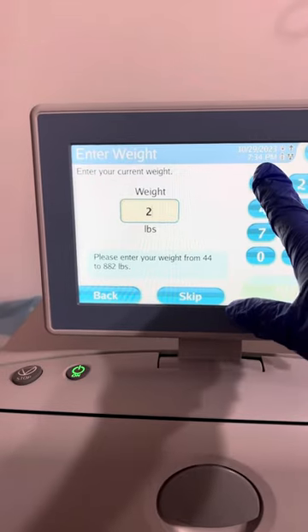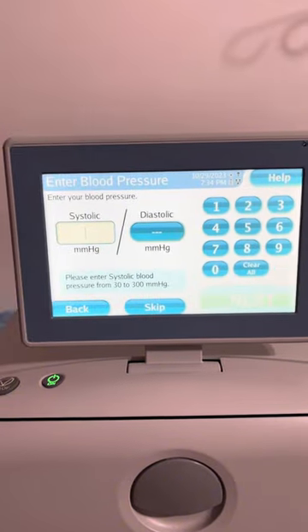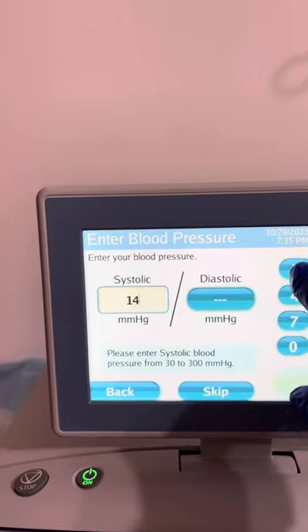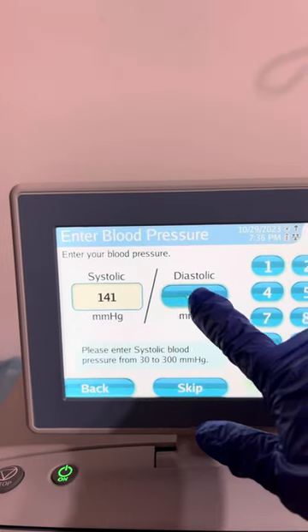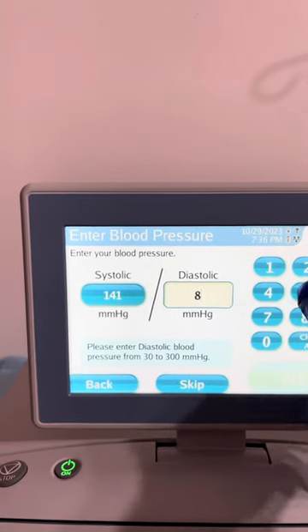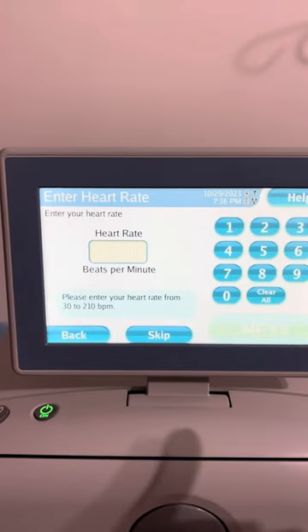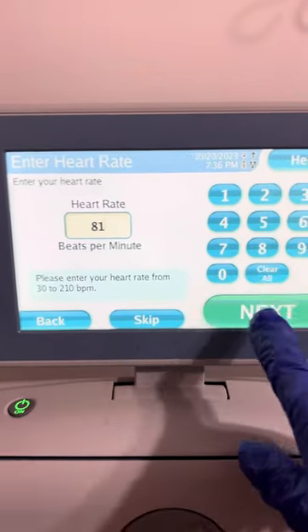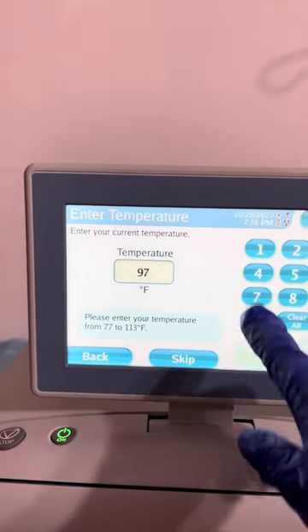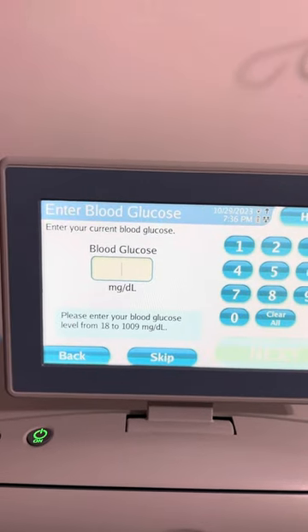And now, right now, I'm recording the vital signs. Encode the vital sign: enter your blood pressure, enter your heart rate, enter your temperature, enter your blood glucose.